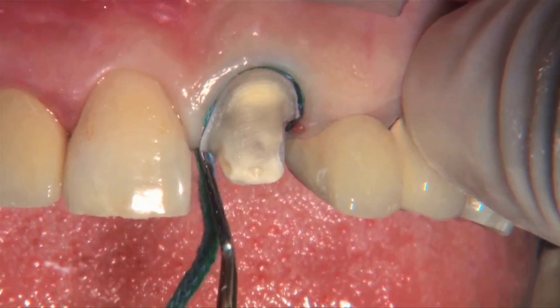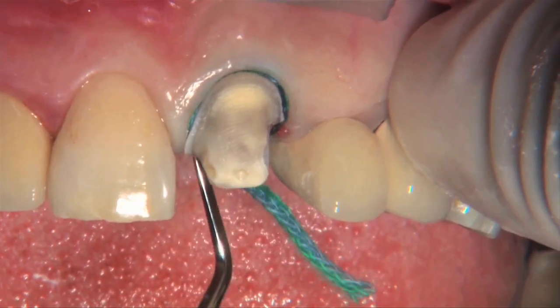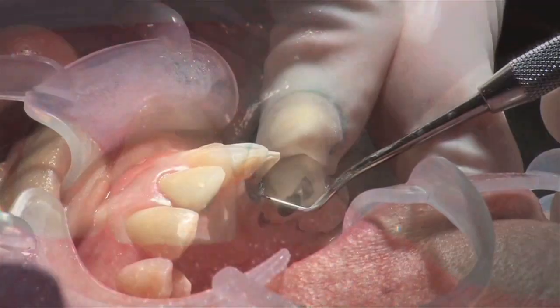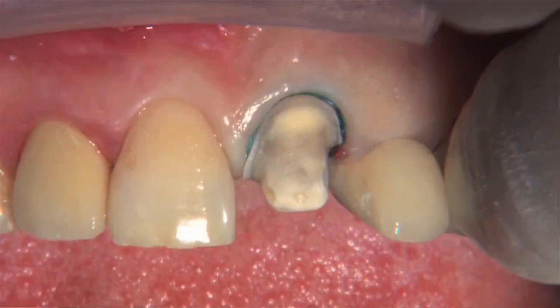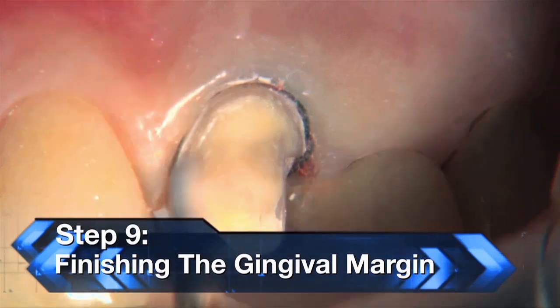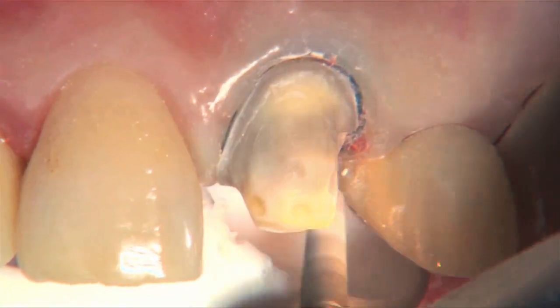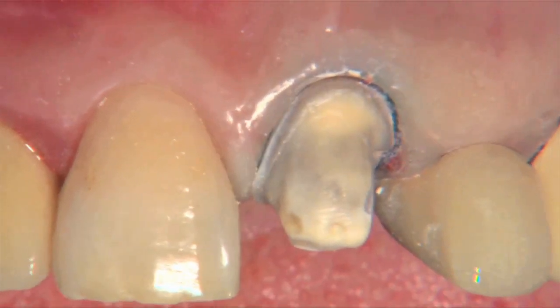So I mentioned with the first cord, we want to have the two ends flush and we cut it that way with the scissor. Here we can have a little extra overlap or a little piece hanging out because we're going to pull this cord out after 8 to 10 minutes, and we want a little tag to be able to grab onto. So we'll cut it and leave a little tag there. Now you might notice that with that top cord in, on the facial we get a little extra vertical retraction. Most of the retraction comes from that first cord that goes in, but here we have a little extra, and this is something I really only do on endo teeth, and that is drop the margin down just a little bit more, still keeping it supragingival, because the cord's in. Once the cord's gone, it'll be slightly subgingival.